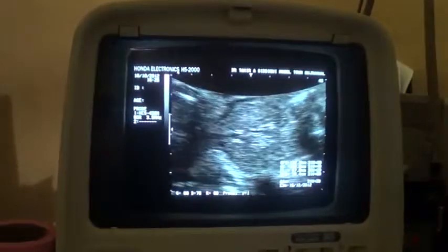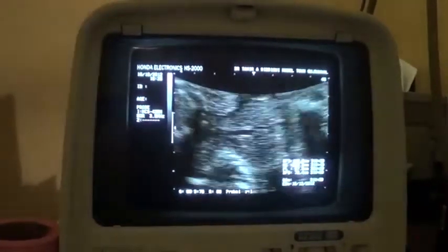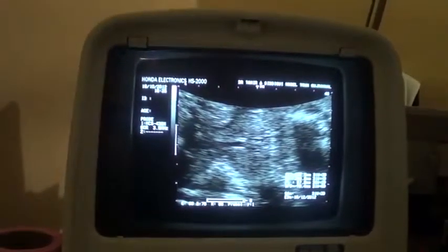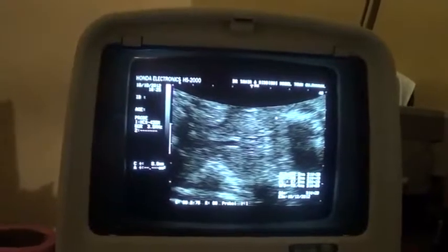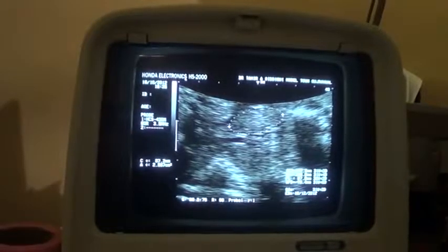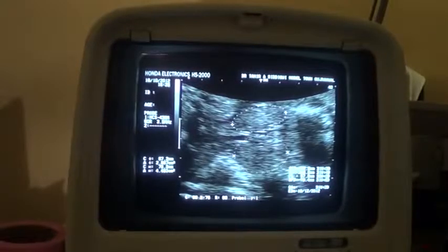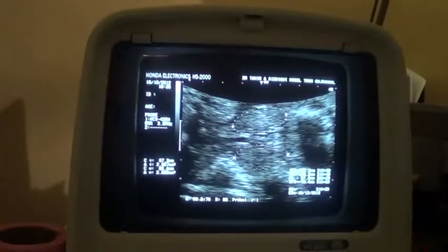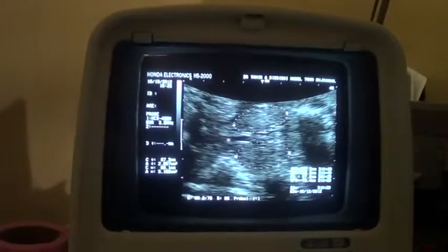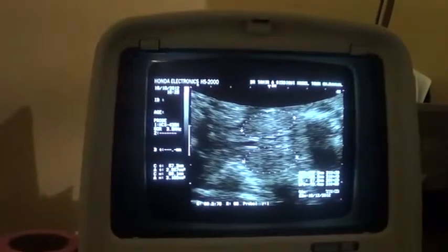But now you see this is the evenly echogenic bilobe mass with a vessel in the center of it, passing through the center. This is the main vessel, and to me, if I am not wrong, it appears to be the superior vena cava.